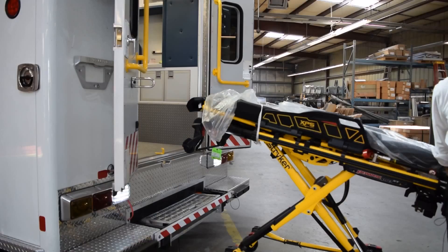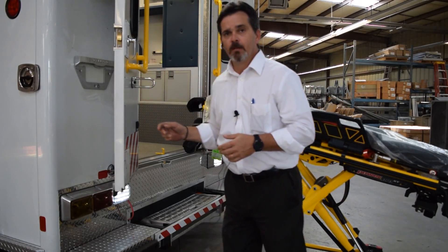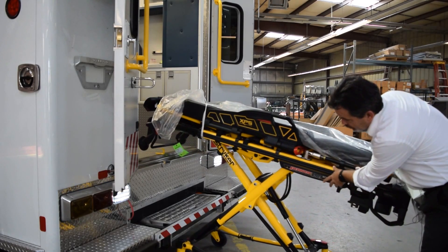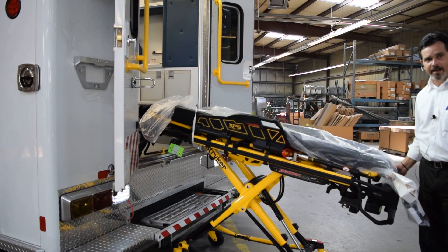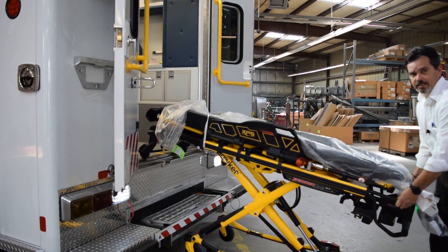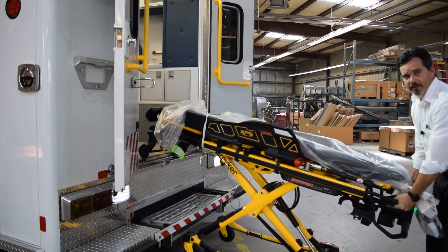That will be its loading position — that's how the cot needs to be when getting ready to load it into the ambulance. With the cot all the way up, push it forward so the safety hook passes over the safety catch, then lower the cot down so it is resting and locked in. You can then carry the weight of the back of the cot.